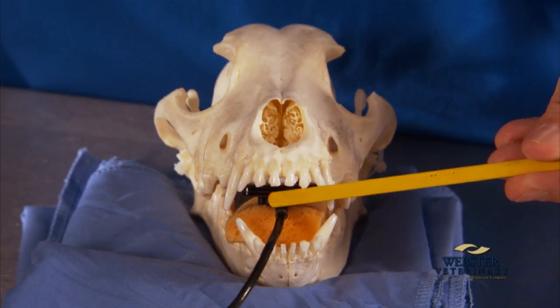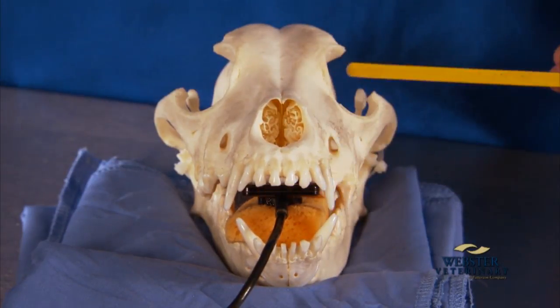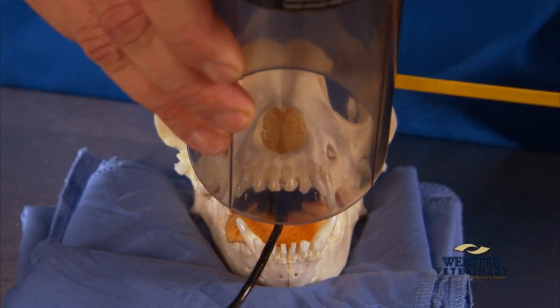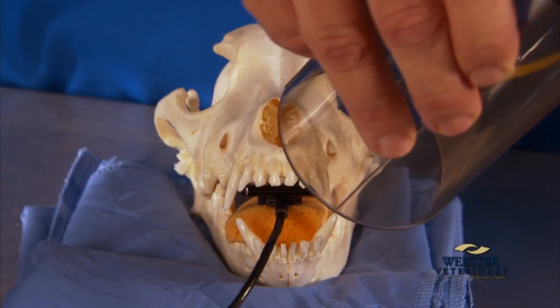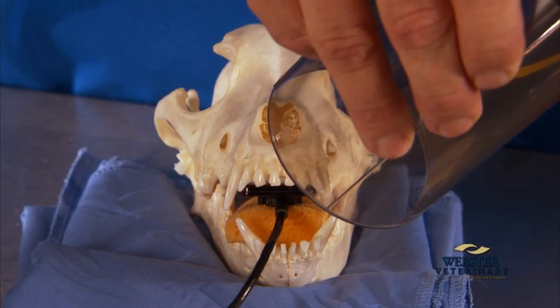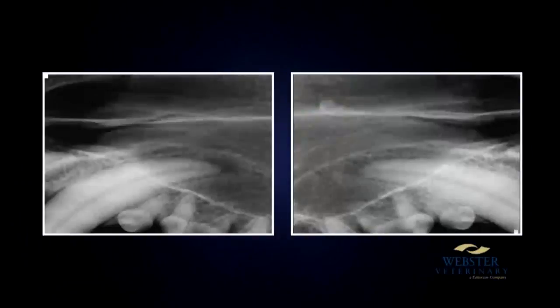The sensor is placed in the mouth, slightly distally, so that it is going to be superimposed over the root structure. The cone head is moved into a position such as this, in a bisecting angle, and rotated 30 degrees to the right to attain an image of the right canine tooth, or 30 degrees to the left to attain an image of the left canine tooth. This will result in cone cutting, where the crown of the tooth will not be visible, but the complete root will be visible due to the size of the sensor when you take this view.